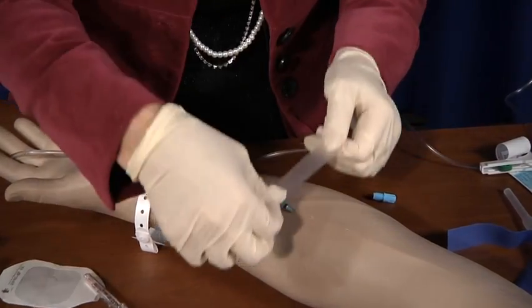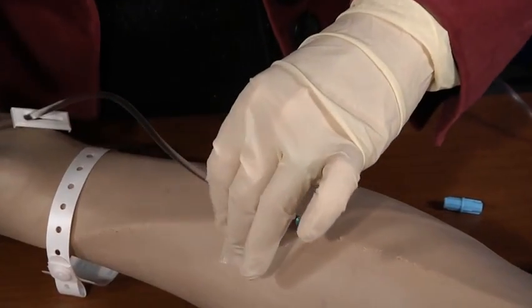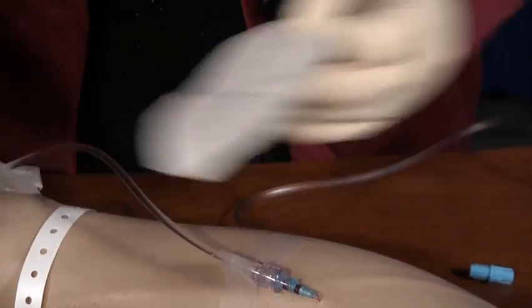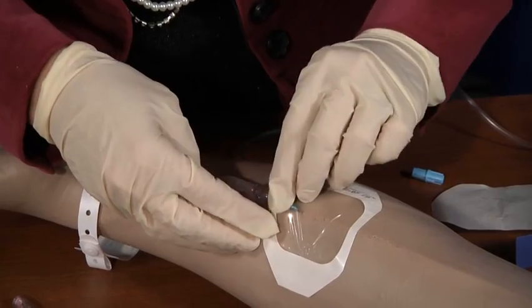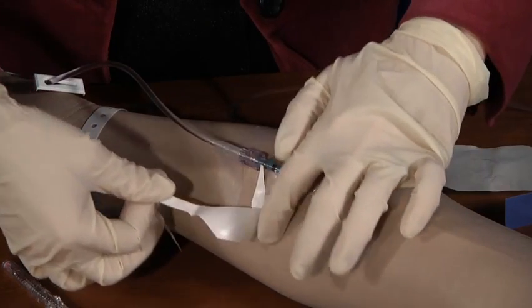Do not cover the site with your tape. You just want to secure the tubing to the patient. The site is what the op site is for. You take your op site and put it right over the insertion site. Now you can still visualize it for any kind of infiltrations or infections, swelling, redness, those type things.